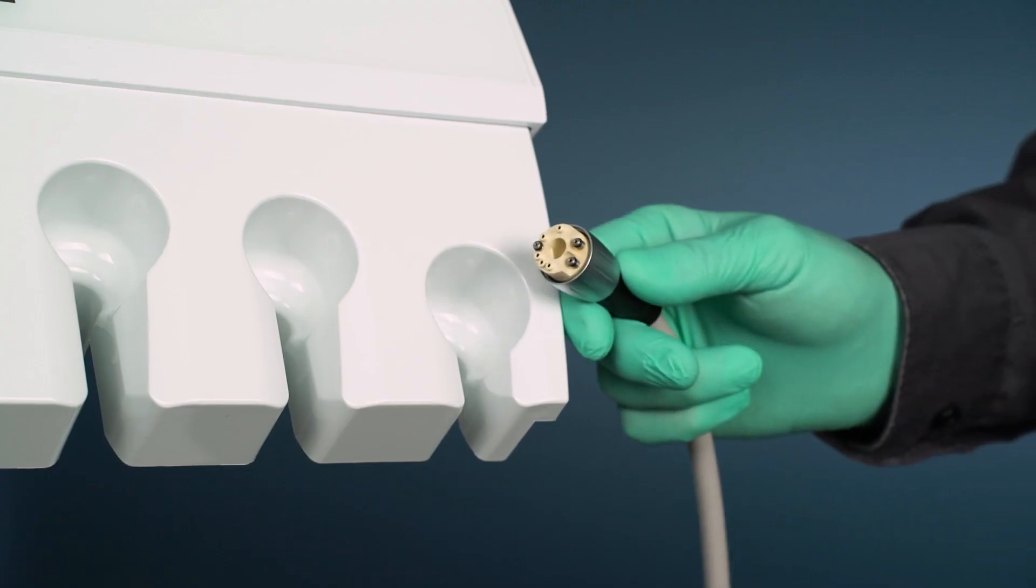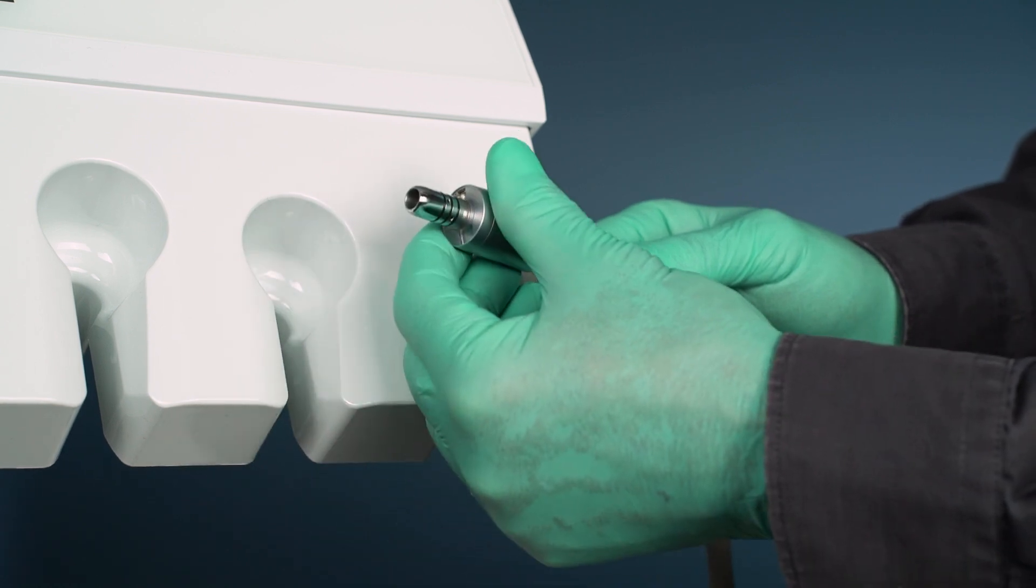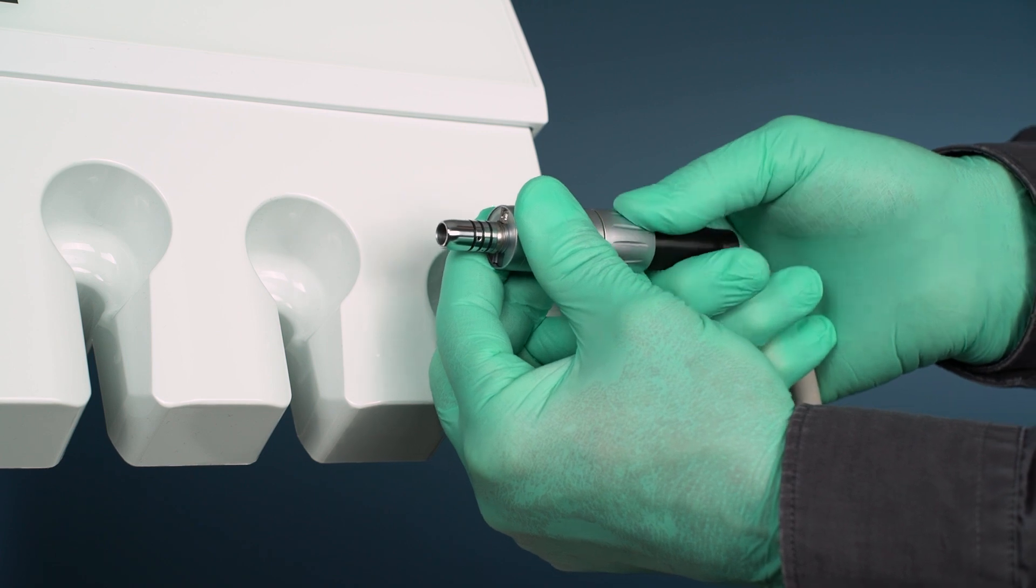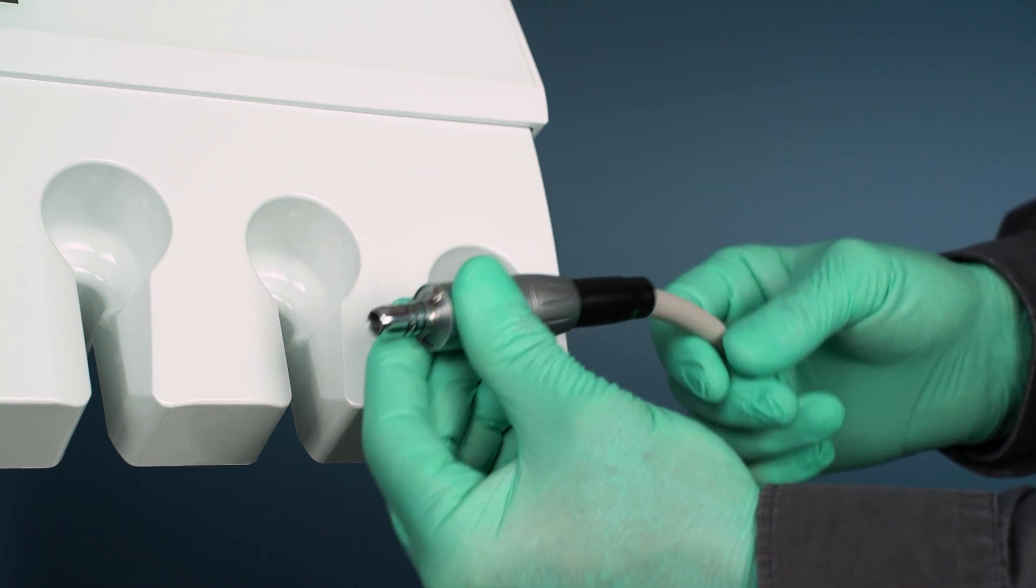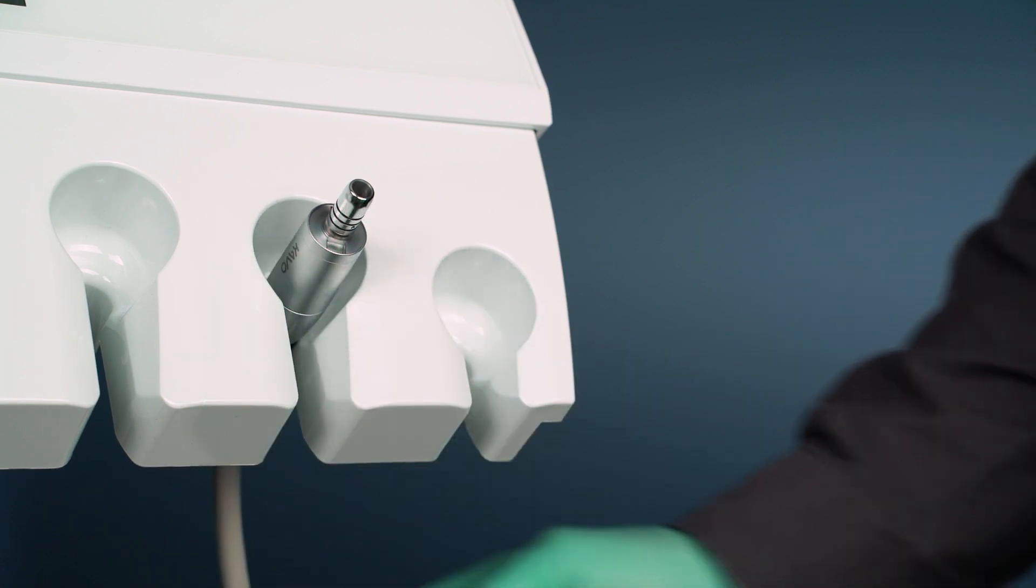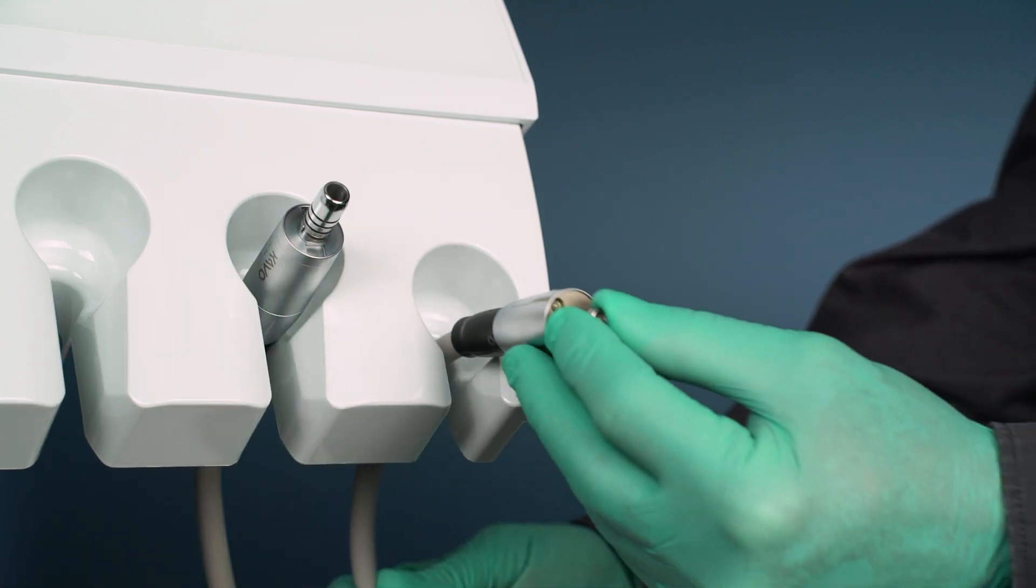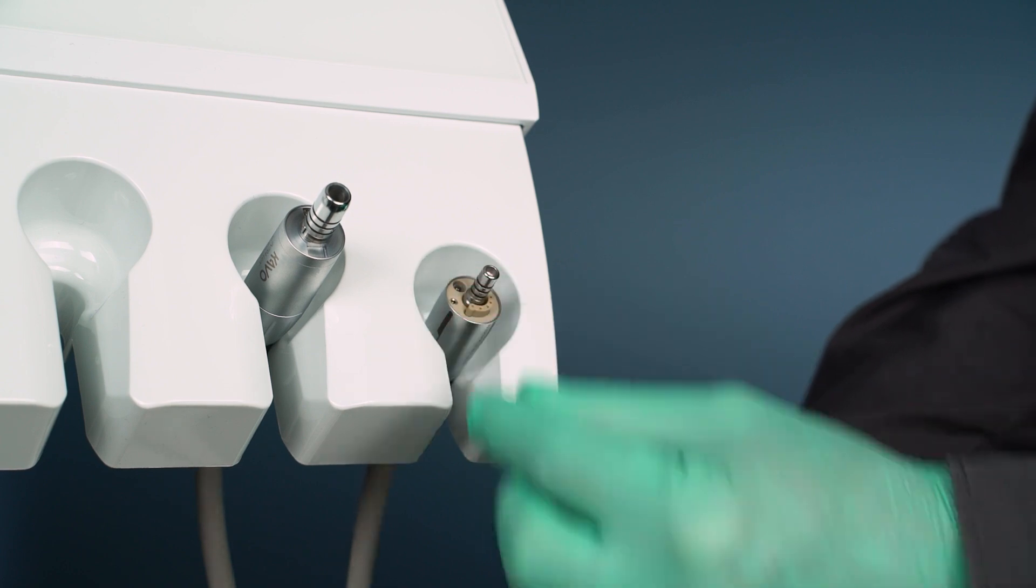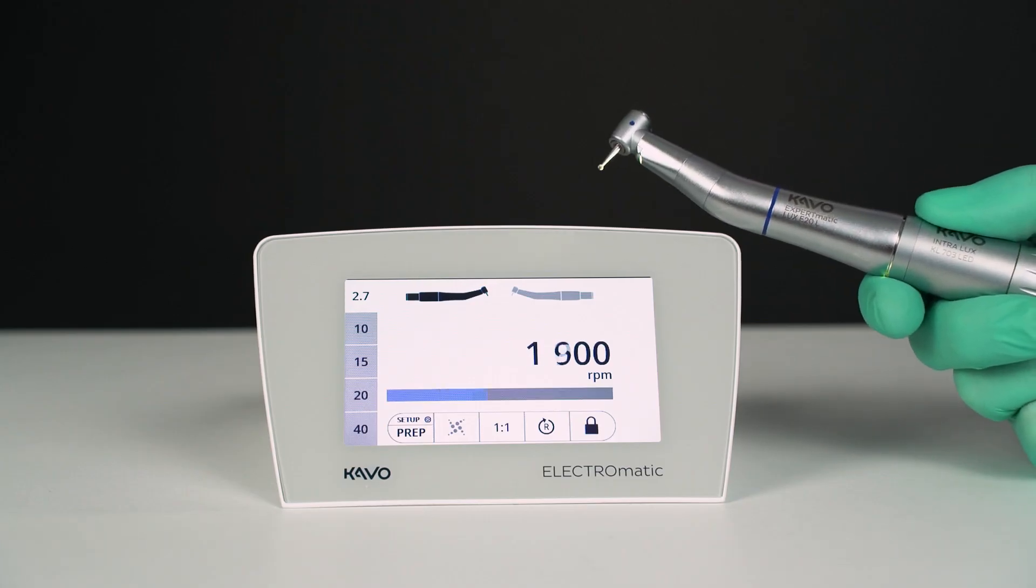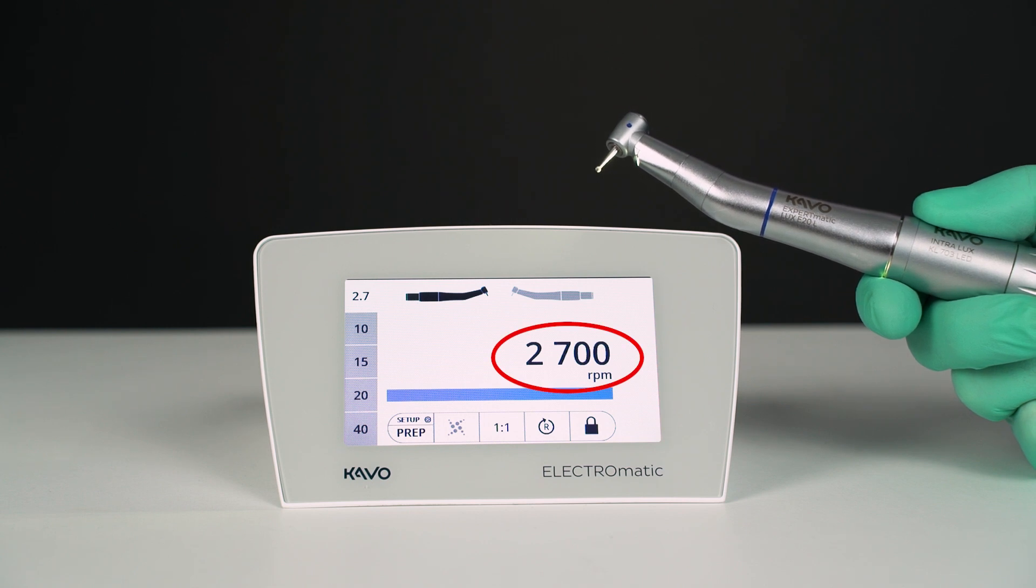The Electromatic is available with the motor hose from the KL703 motor with 40,000 rpm, which is the connection for all intra-hand pieces and contra angles. Or it is available with the comfort base hose, the connection for the short and ergonomic speed increasing comfort drive hand piece. The motor setting is adjusted to 2700 rpm max.